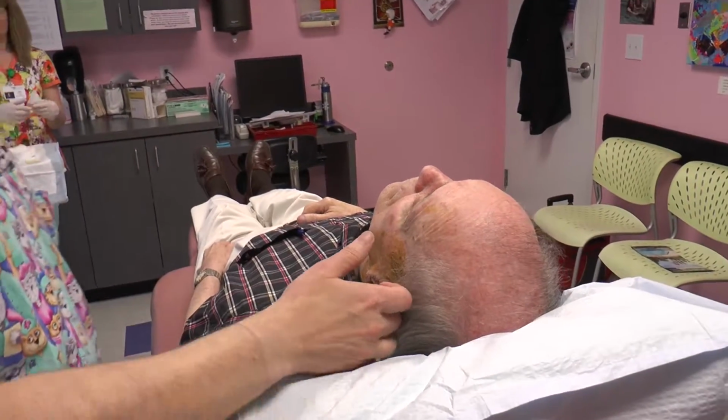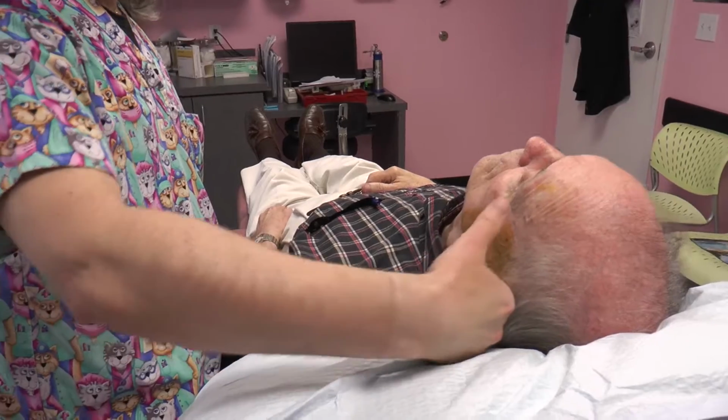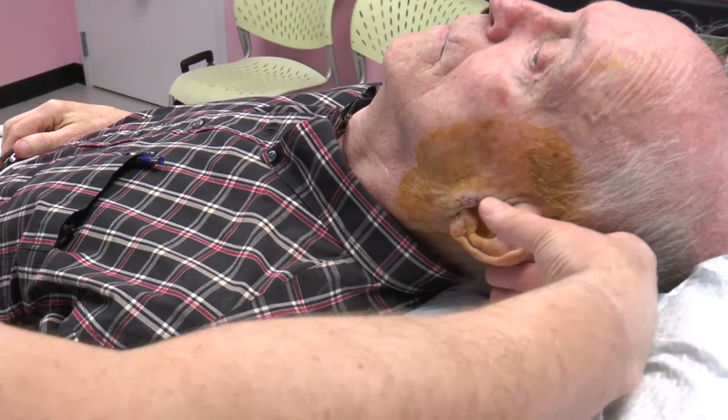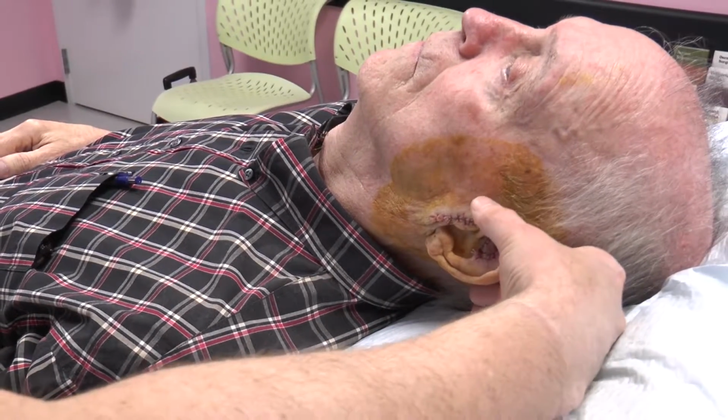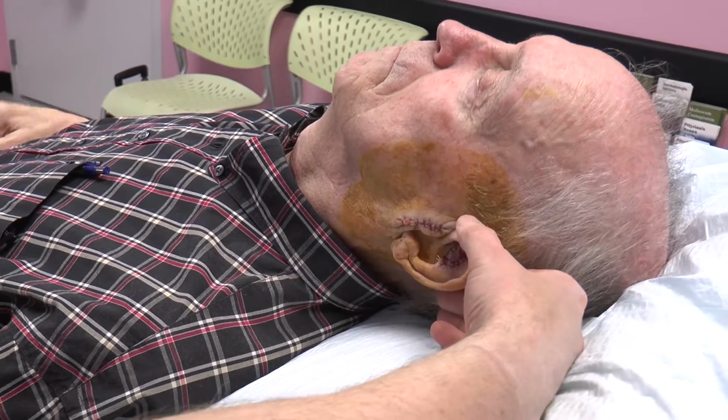One of the tricks of bandaging is we're going to try to put these dental rolls behind to create a support, like my fingers. Then we're going to cover over and put another support. There's always a balance of how big is the bandage and how much do you hate the bandage.